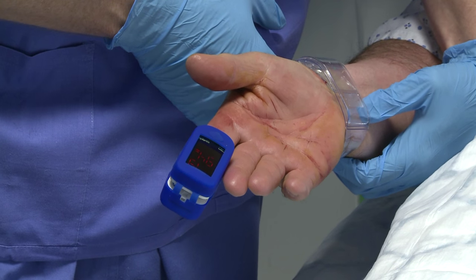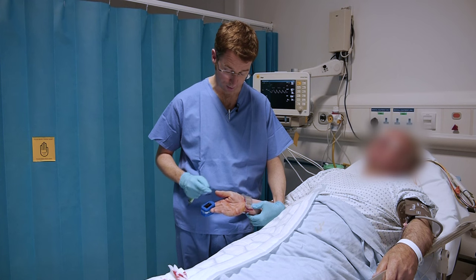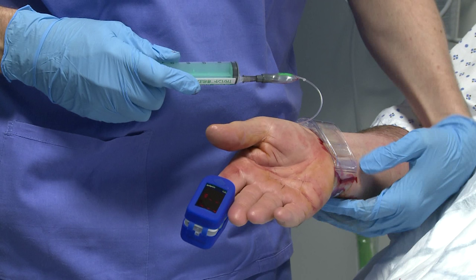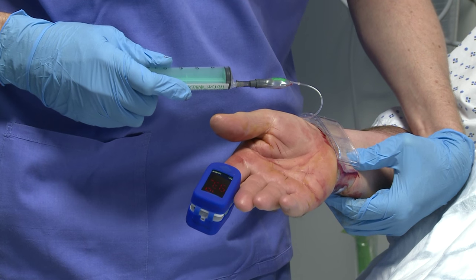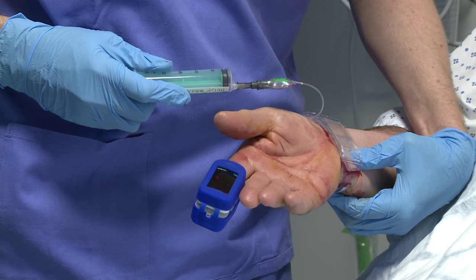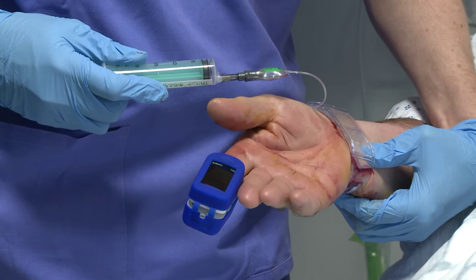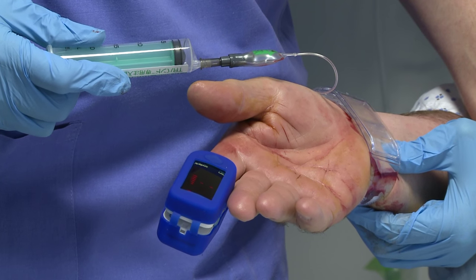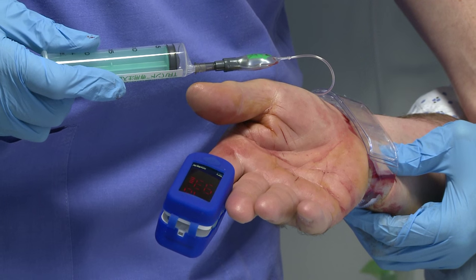If we now occlude the ulnar artery — just pressing here — we see that we have a loss of flow, telling us that we still have occlusion of the radial artery. So now what we'll want to do is withdraw some air from the TR band with a view to seeing where we achieve flow back through the radial artery. Here with the ulnar occluded, I gradually withdraw air until we start to see flow. And there we're starting to see a waveform again. We've only withdrawn about two mils in total. Still with occlusion of the ulnar, we can see that we're getting a waveform and a saturation measurement through the radial artery circulation.